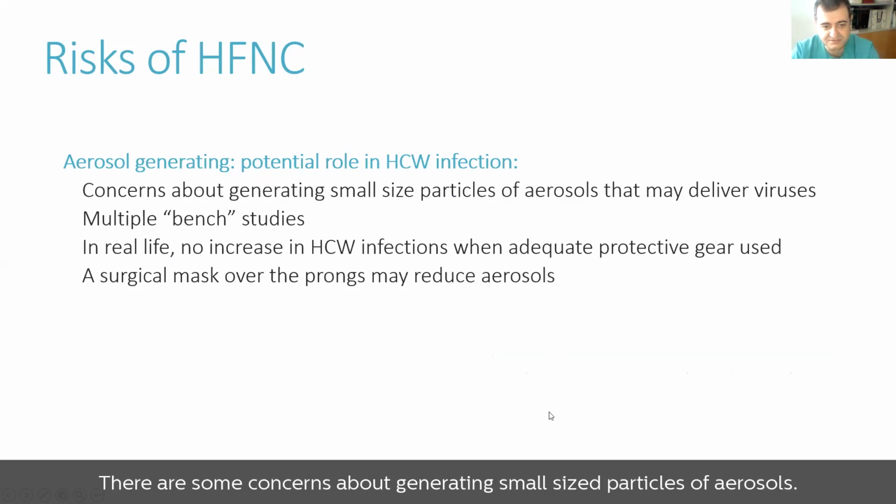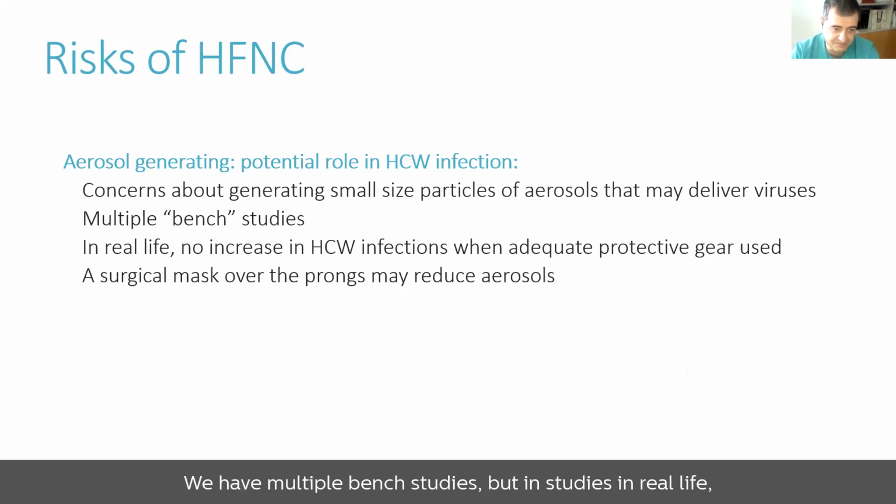There are some concerns about generating small size particles of aerosols. We have multiple bench studies, but in studies in real life, there was no increase in healthcare worker infections when adequate protective gear, such as FFP3 mask, gowns or glasses, were used. And a surgical mask over the prongs may reduce aerosols.